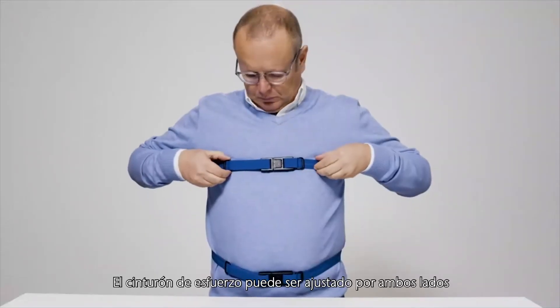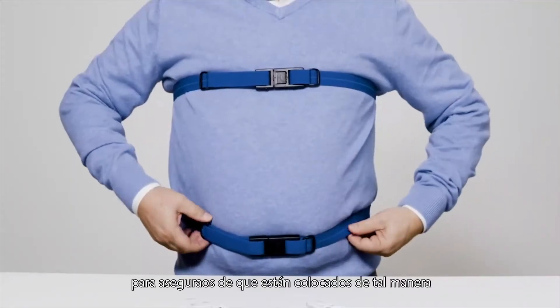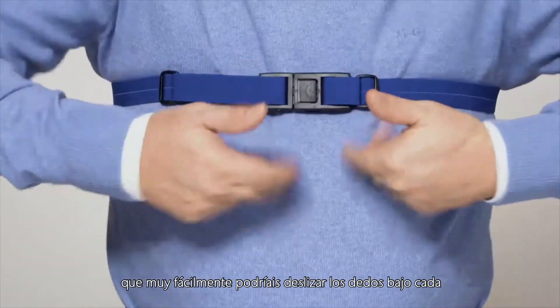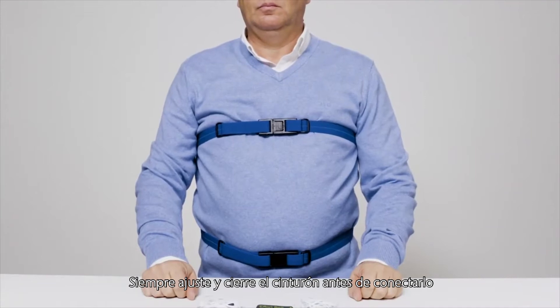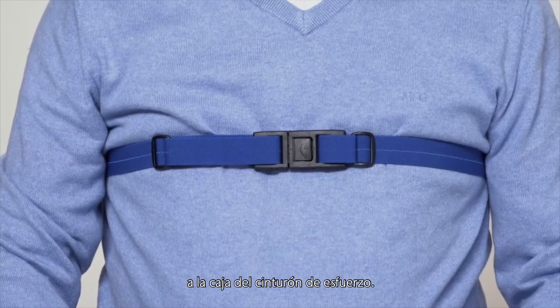The effort belt can be adjusted at both sides of the buckle to make sure they sit in such a way that you can easily slide your fingers under each belt. Always adjust and close the belt before you connect the white wires that connect the belts to the effort belt box.